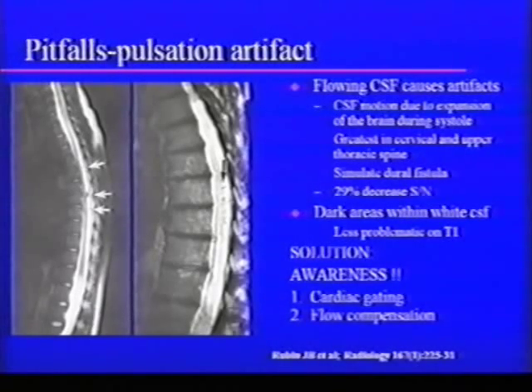What can happen, though, is you get pulsation artifact. Pulsation artifact is because as your heart beats, as you're sitting there, your brain gets bigger and smaller, okay? And it causes your CSF, your spinal fluid, to move, and then you don't actually get all the signal back from your fluid. You get little dropouts, little dots like this. So what you have to be careful of is that pulsation artifact, and not call that a dural fistula. Because if you call that a dural fistula, then you're going to be referred to me and I'm going to do a spinal angiogram, which is going to take about an hour of your time. And if you don't need it, you don't need it.